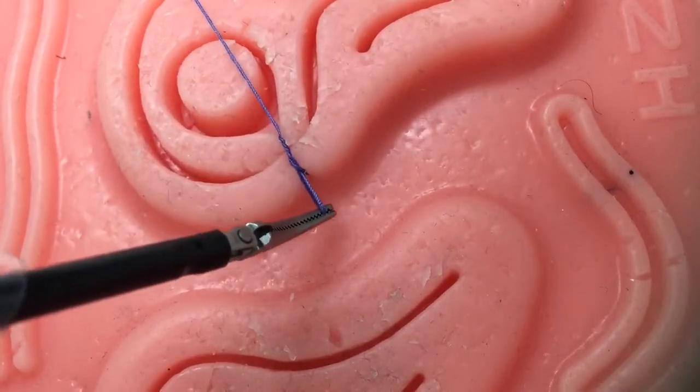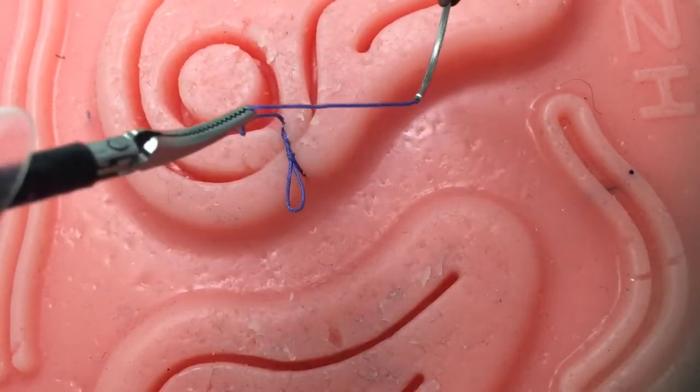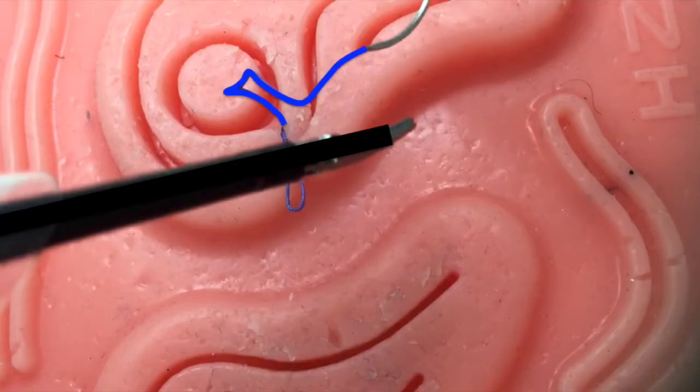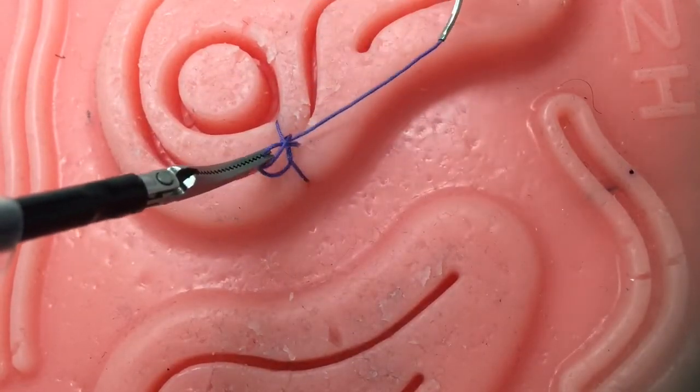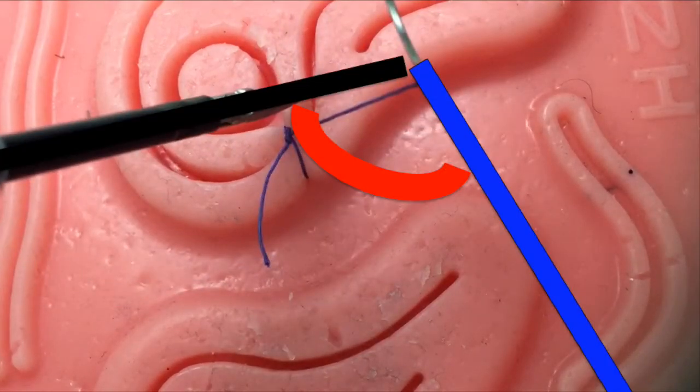Remember to alternate your throws by placing your left instrument on opposite sides of the suture. And again, always rotate the needle to line up with the suture to minimize the instrument to suture angle.